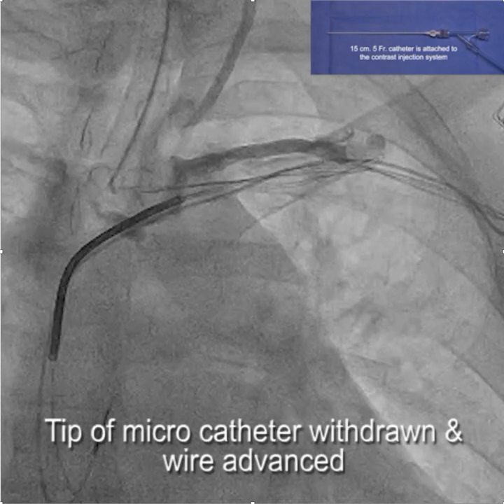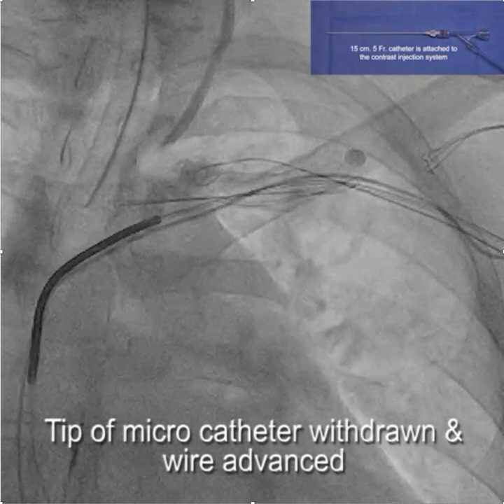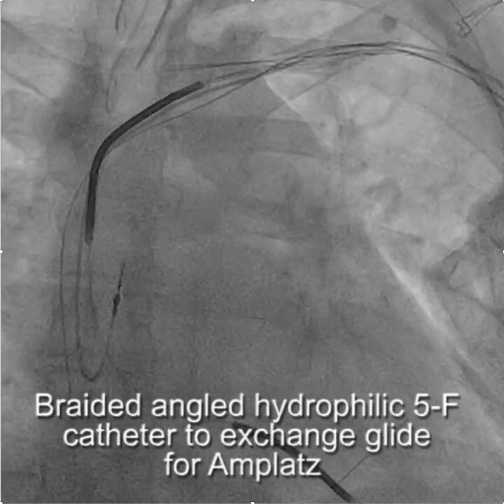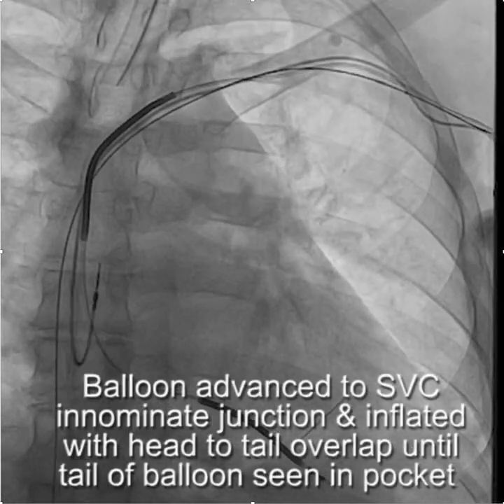As we back up, we inject carefully and carefully advance the wire — not quite there yet. We back up a little more, and now the wire goes down. So if you just followed the wire you'd say this was a total occlusion and you can't get through, but by using contrast you can see that you actually can.